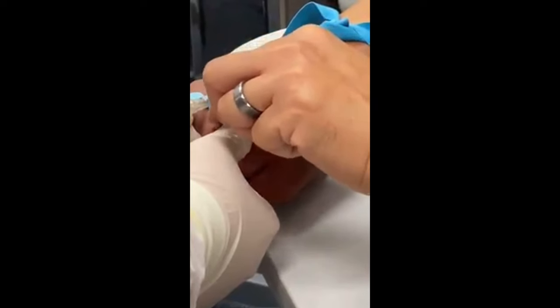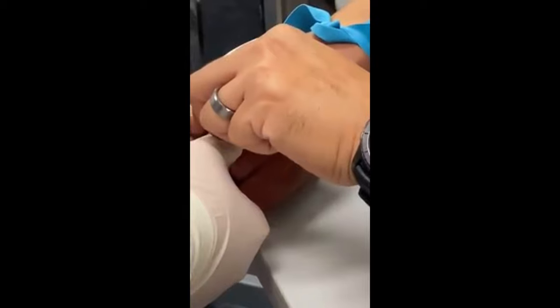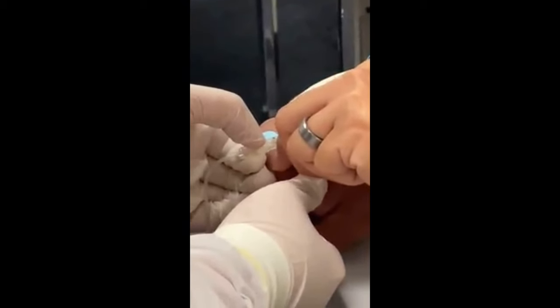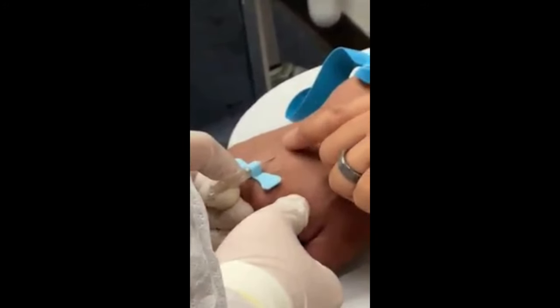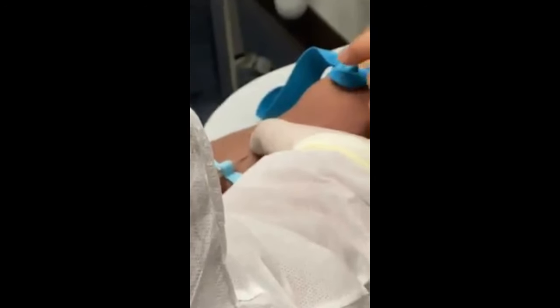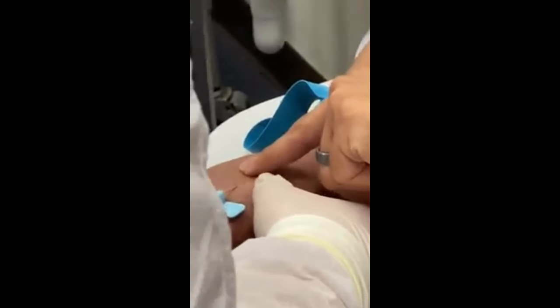Yeah. Oh, you could just try advancing it slowly. So it's already at the halfway point. So just pull back a little bit, and as long as the bevel doesn't come out, go in the direction of the vein that you think it is. Okay, but don't go in too deep.